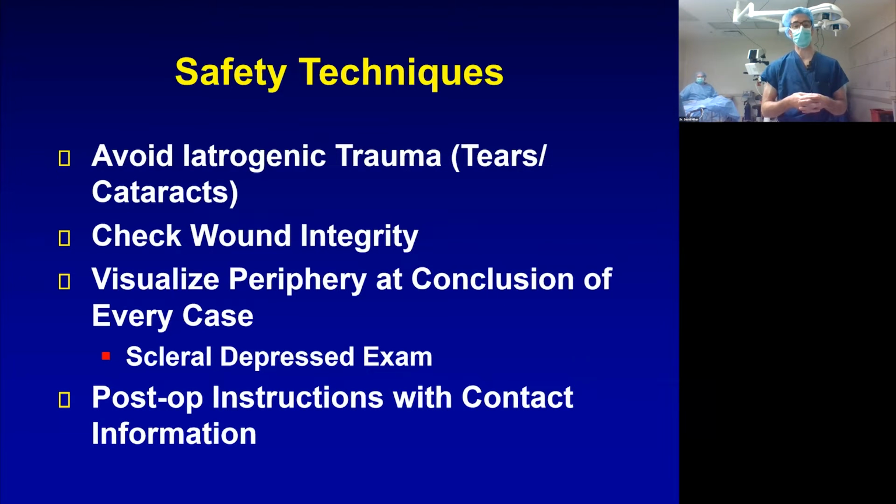You want to avoid iatrogenic trauma, retinal tears and cataract being the main ones. You want to check the wound integrity. You want to visualize the periphery at the conclusion of every case, scleral depressed exam. And you want to give post-op instructions with contact information.